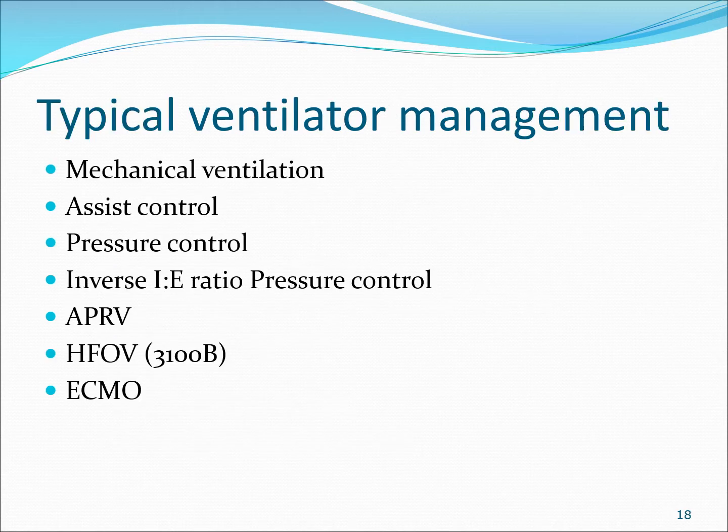So let's talk about managing the patient on mechanical ventilation. The patient failed non-invasive ventilation, so you decide to intubate, and you have a successful intubation. Now, typically when we intubate someone, we would probably put them in assist control or SIMV to initially start, and we'll set up a tidal volume based on their ideal body weight. You'll set a PEEP level that is effective.